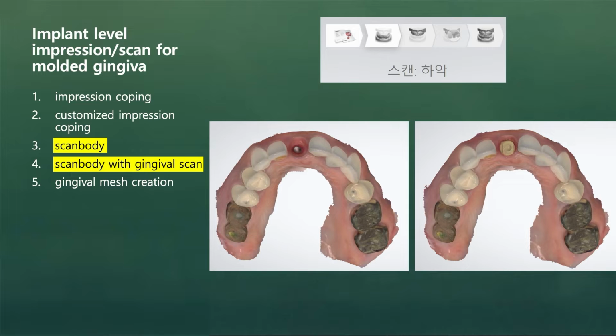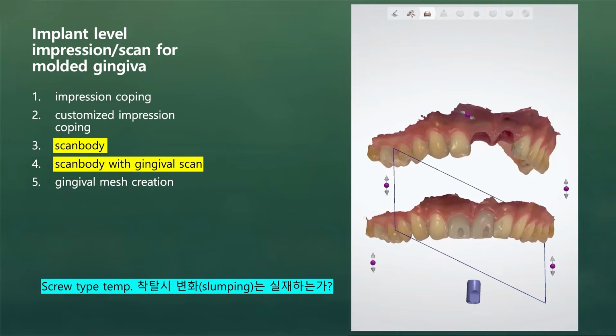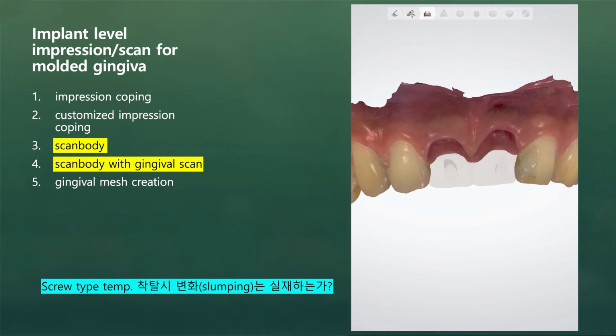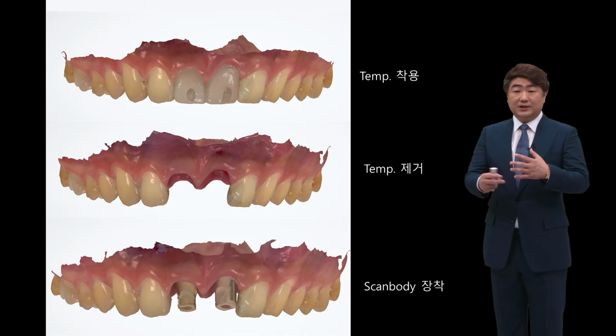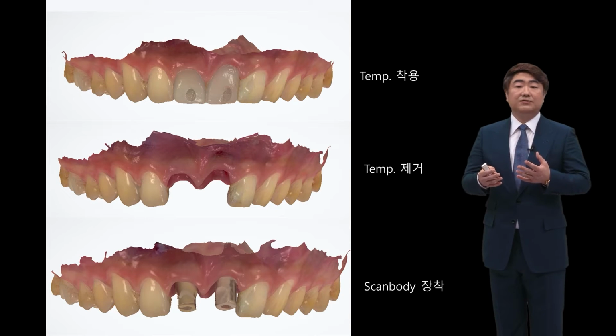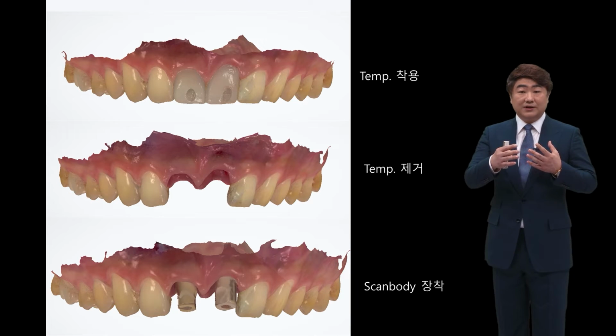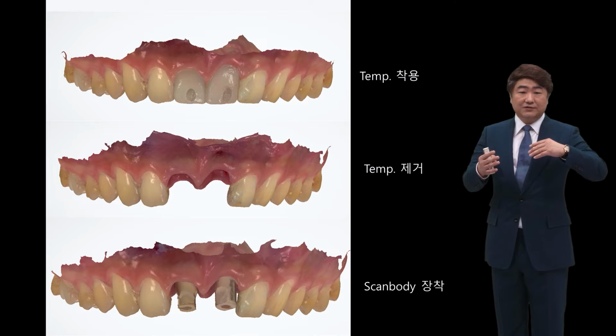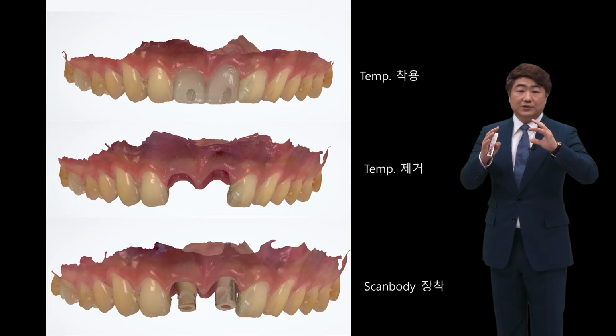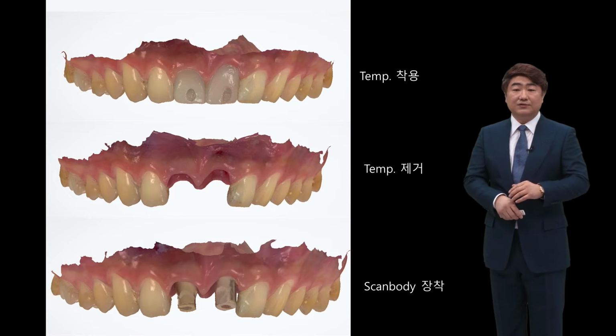Hence, would gingiva collapse not happen? Compared to using an impression coping, what has become better? Actually, whether the gingiva collapse or slumping happens, let's compare. With digital technology, it's easy to compare through superimposition. So in the video, when you remove the temporary and attach the scan body, let's compare everything. These 3 scans are not just erasing the scan body, they are totally different scans on the gingiva area, 3 totally different scans.